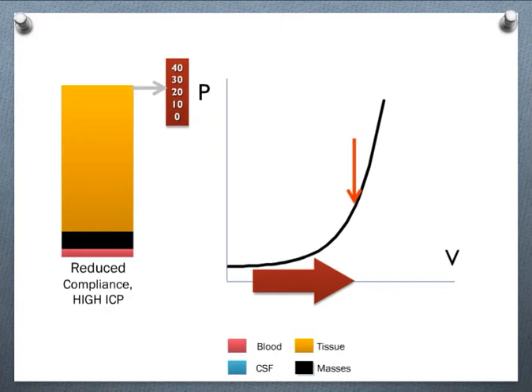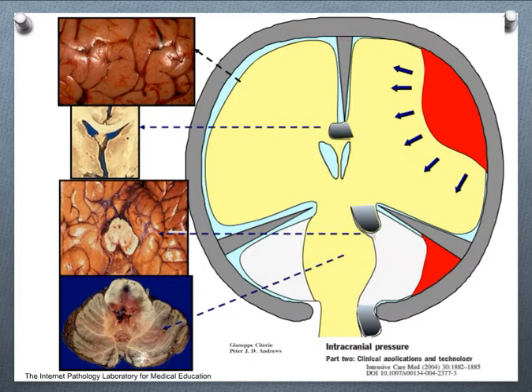So why we care about that? Because pressure produces gradient inside the skull, and we don't want, for example, to have a compression of a brainstem. And if we have high intracranial pressure, maybe we can have some clinical sign. We will discuss tomorrow with Tarek. The pupil unreactive is a sign of high intracranial pressure, but nowadays it's better to avoid this situation treating ICP before. We have some gradient inside the skull. We don't discuss about that, but the position of the probe could be influenced by this gradient you can see in this slide.